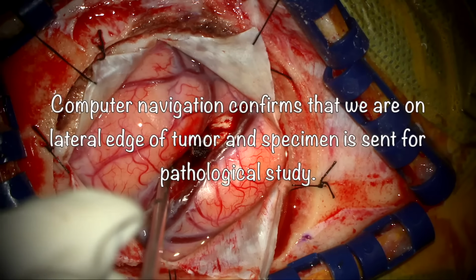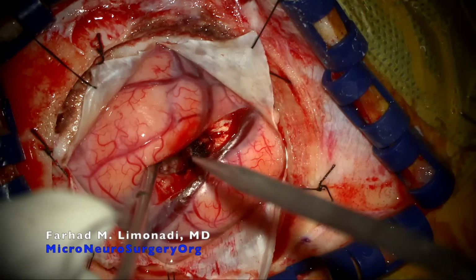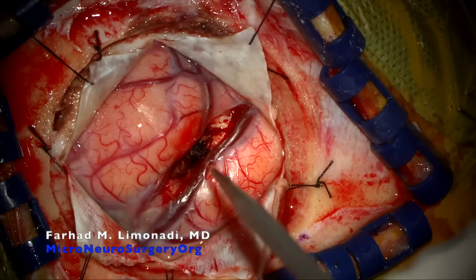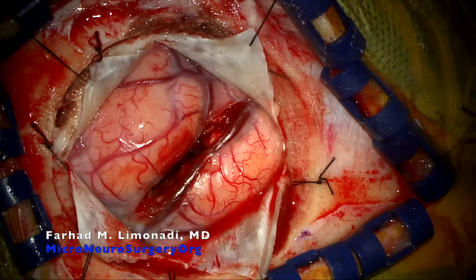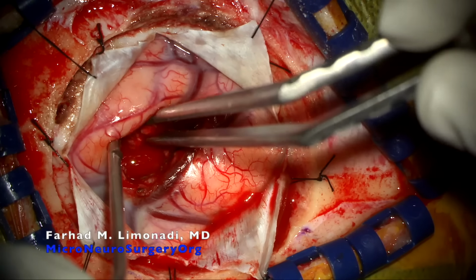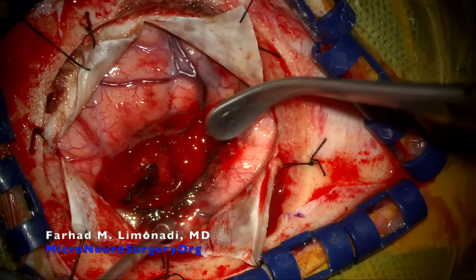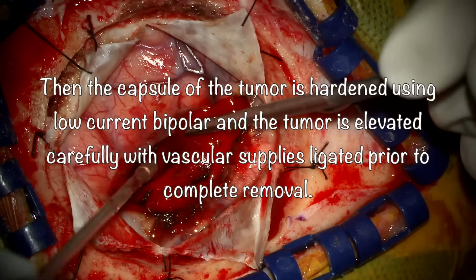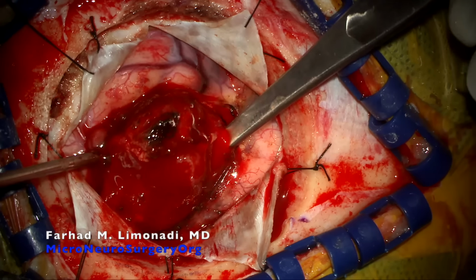Computer navigation confirms that we are on the lateral edge of the tumor and a specimen is sent for pathological study. Then the capsule of the tumor is hardened using low current bipolar and the tumor is elevated carefully with vascular supplies ligated prior to complete removal.